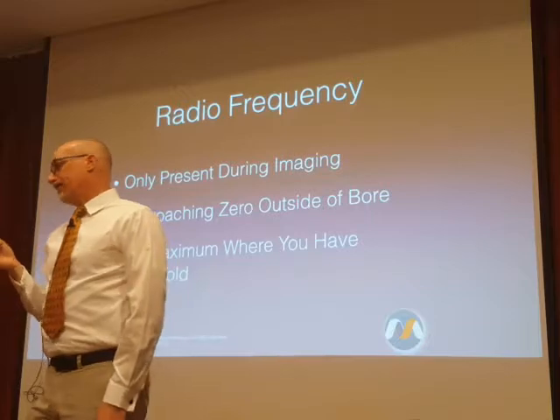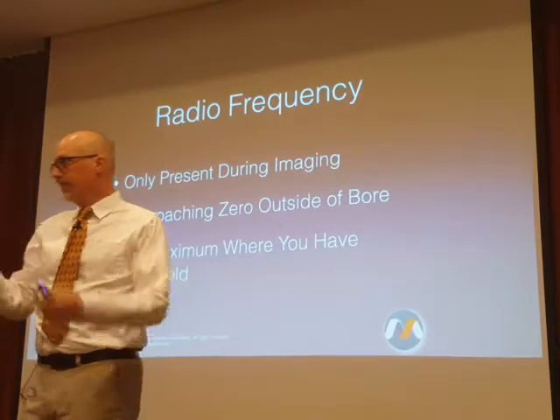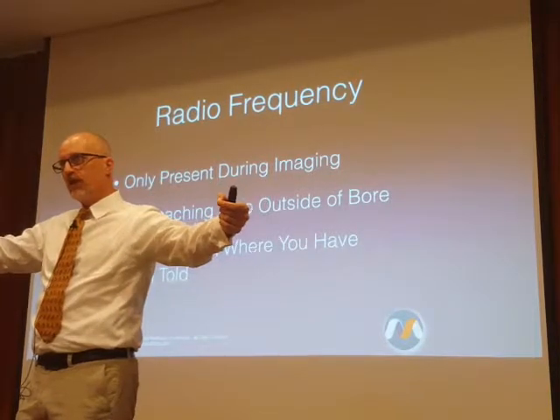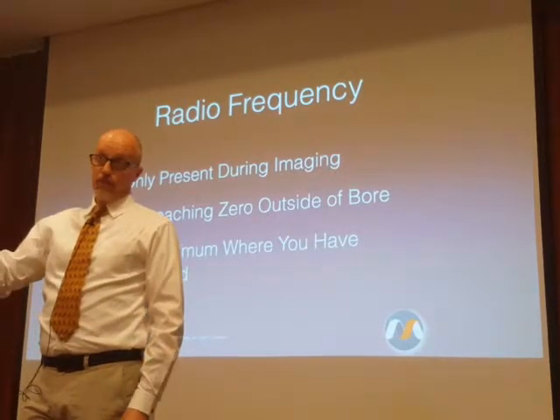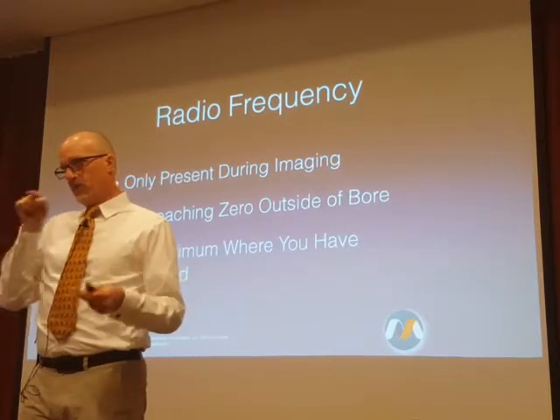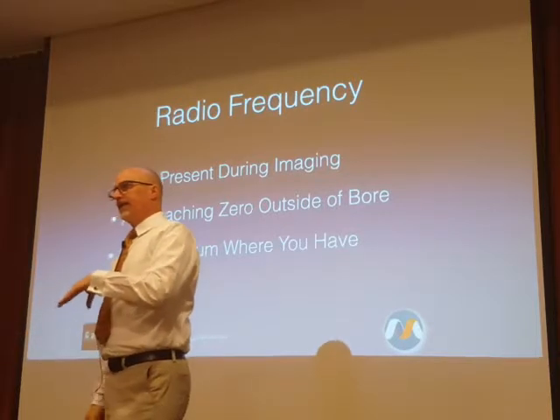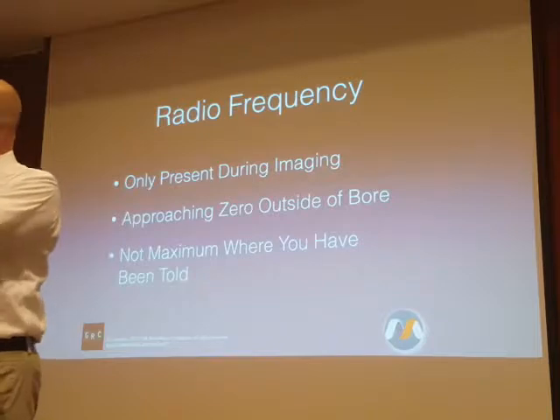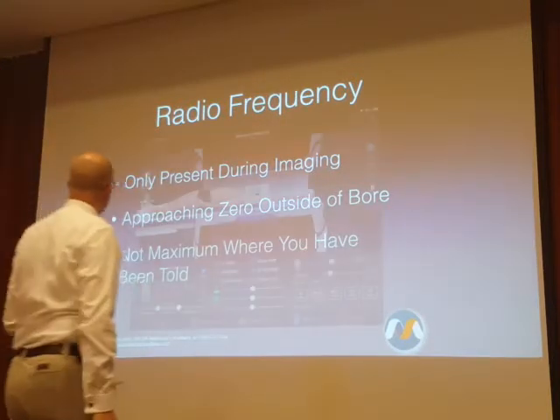I won't say that drawing or that plot is a lie. It's not, because it's giving you the values along the central z-axis, right down the middle of the bore. What it doesn't tell you is what that energy distribution looks like anywhere other than right down the center. If you look at that plot, it would lead you to believe that the radiofrequency transmitters are right in the middle of the bore. And in fact, that's not the case at all.